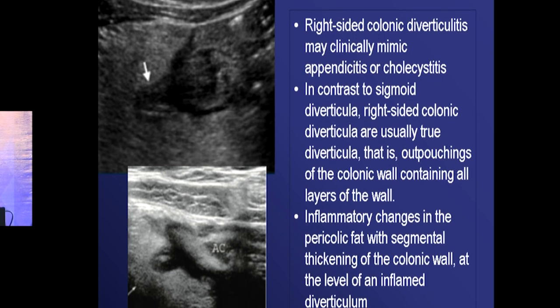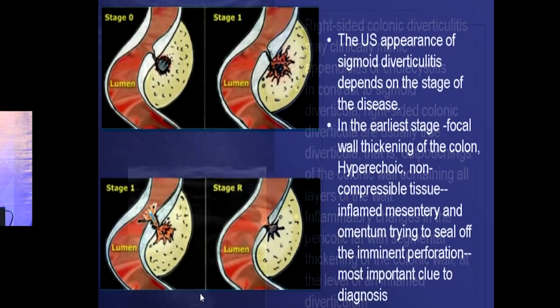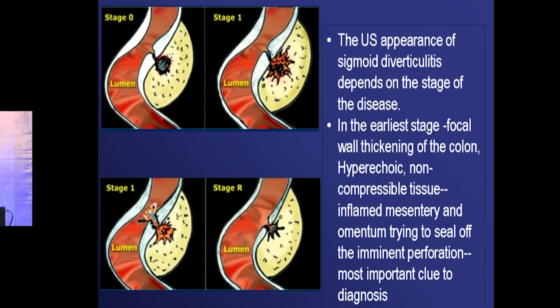In contrast to sigmoid diverticula, right-sided colonic diverticula are usually true diverticula with all layers of the colonic wall. The typical sign is inflammatory changes in the pericolic fat with segmental thickening of the colonic wall at the level of the inflamed diverticulum. There will be an outpouching with fat stranding around it — that is typical diverticulitis, right- or left-sided, following a similar pattern.